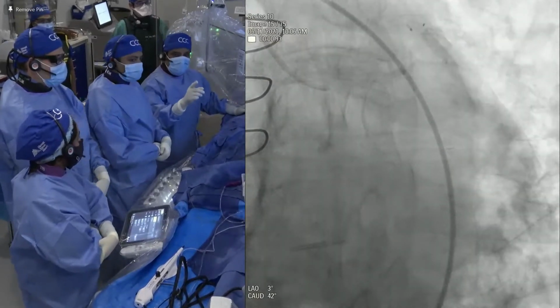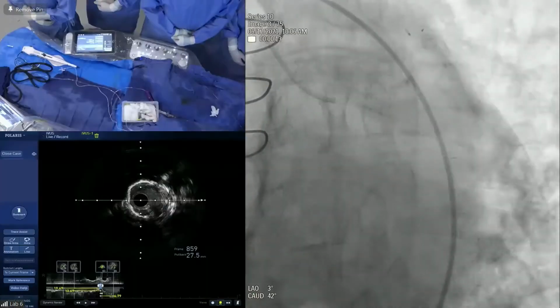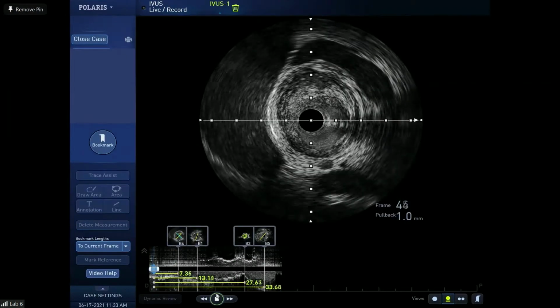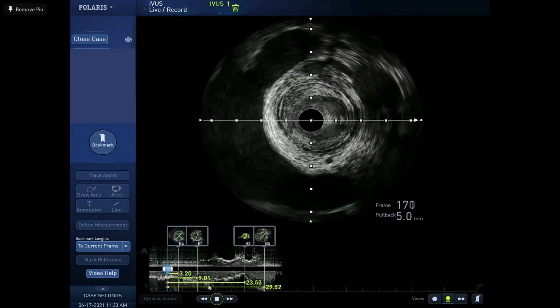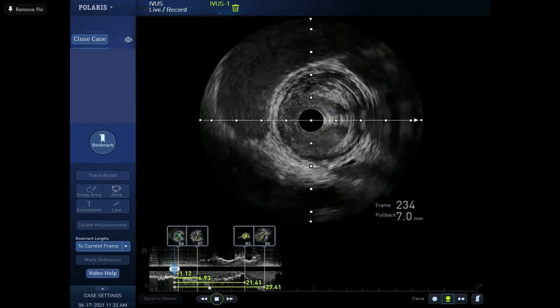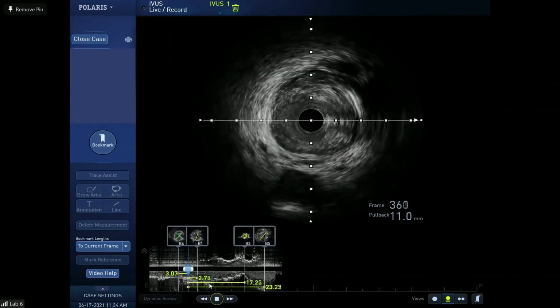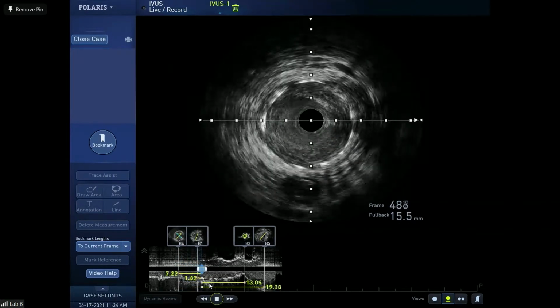Can we show the IVUS? We did the IVUS in this particular case. Oh, you were able to pass an IVUS there. That's cool. Yeah, here, so we start. Play the IVUS from distal to the enlarged OM. There's a plaque there, which we know, moderate disease. It looks like they don't even have all that disease covered. They did not cover the entire disease.